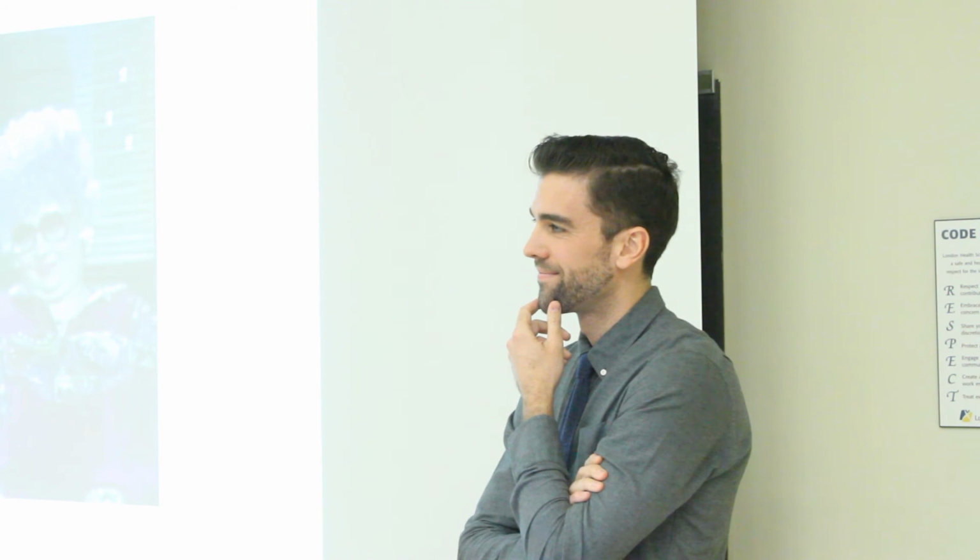Just when those guidelines first came out, we tried it about three times downstairs for cardiac arrest. But as Myron alluded to, by the time he got it warmed up for two minutes and then did the calibration, it didn't seem to work that well, and I think it worked about one out of the three times that we tried. That was the inline, but now we've moved on to the other. So knowing now that it's a lot easier, it's pre-calibrated, you just plug it in, do you think you'd go back to using it? Yeah.